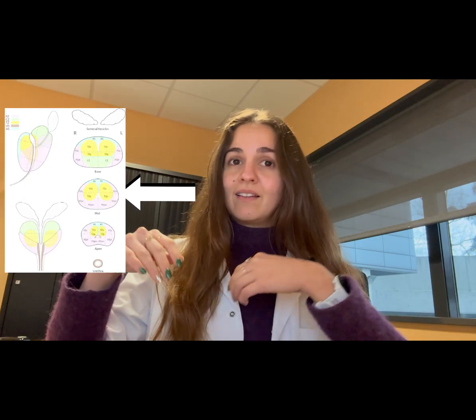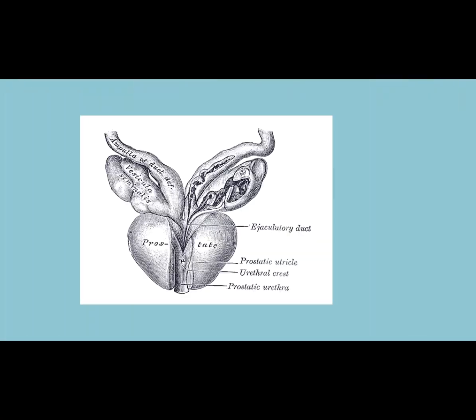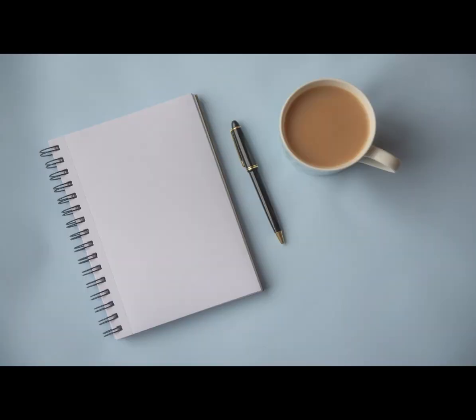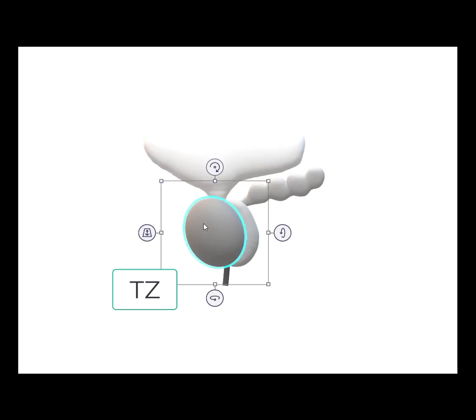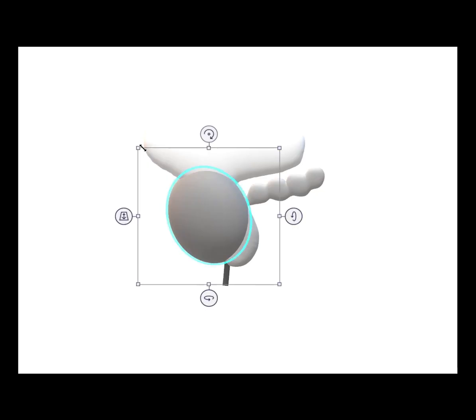In fact, our sensitivity for lesion localization is better in the middle gland than in the apex or in the base. This discrepancy arises because of anatomical variations due to the embryologic and anatomical complexity of prostate development. For example, the anterior expansion and the middle lobe, classified by the Randall system, make the anterior part of the prostate higher than the peripheral part.